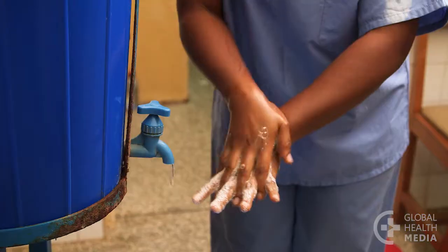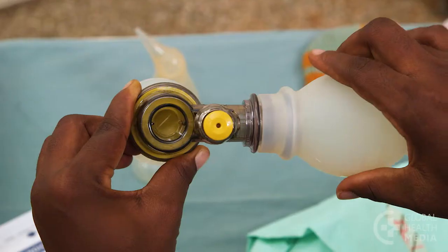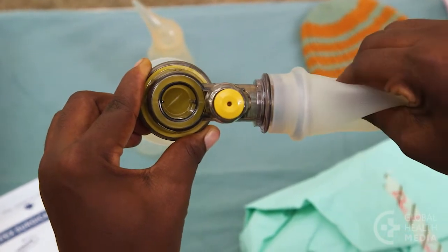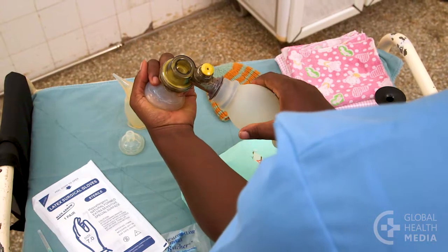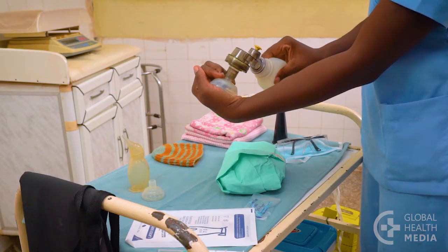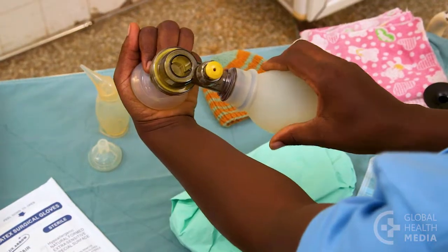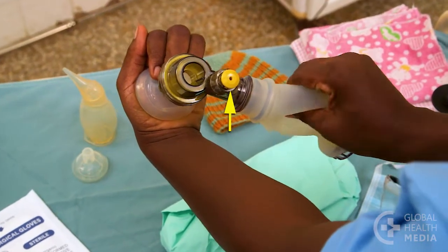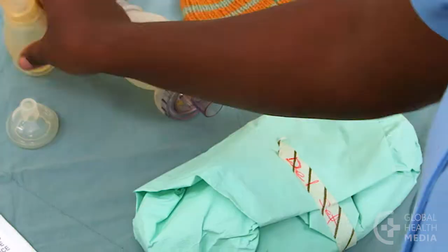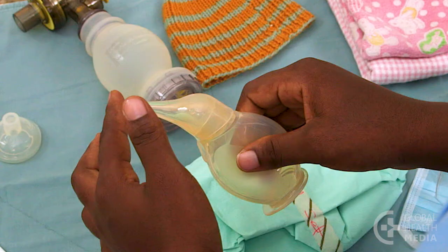Wash your hands, then check your resuscitation equipment. First, squeeze the bag and watch for the valve to open and close. Next, make a seal with your palm and squeeze the bag — you should feel pressure against your hand, see the bag re-inflate, and hear air escaping from the pop-off valve. Then test your suction device: squeeze it, block the tip, and release. It should not expand until the tip is free.